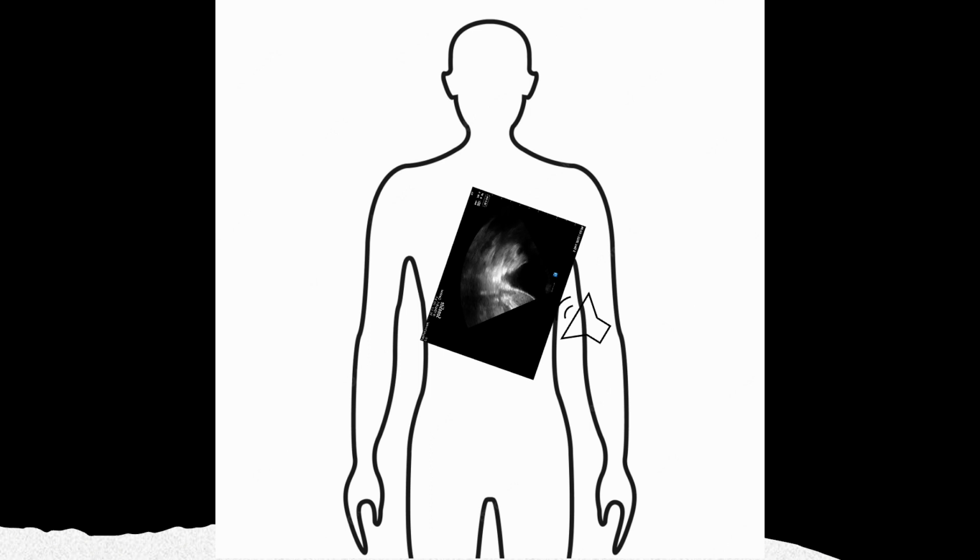And if you look closely, you can see on the left side something moving, another black dot, and that's the heart that you can see all the way from where I'm putting the probe because of the fluid.